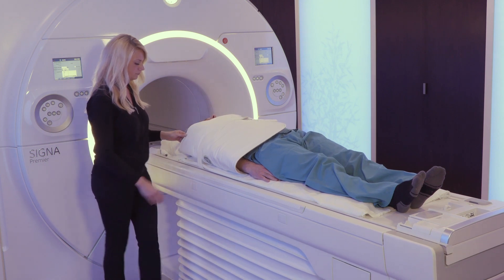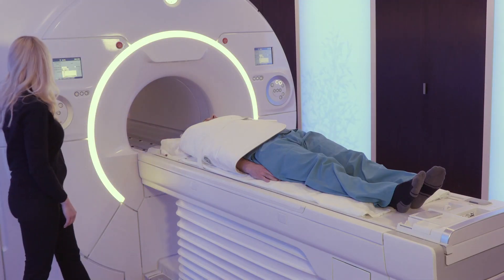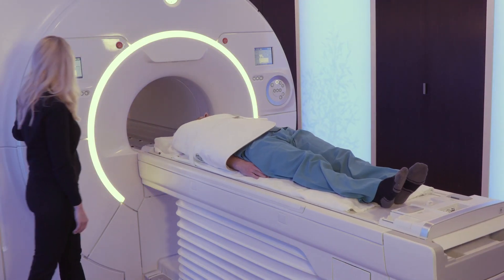Use the IntelliTouch Strip to do a quick and easy one-touch landmark of the patient. And now, you're ready to scan!